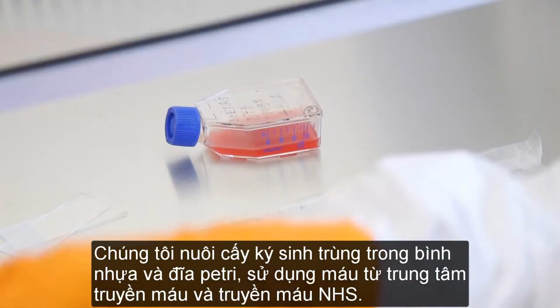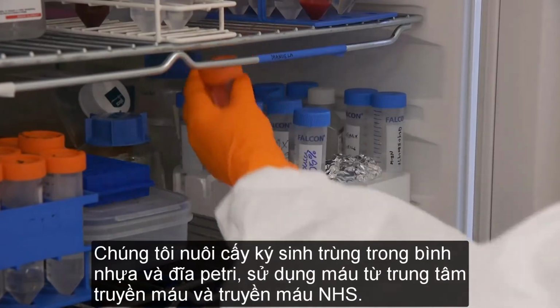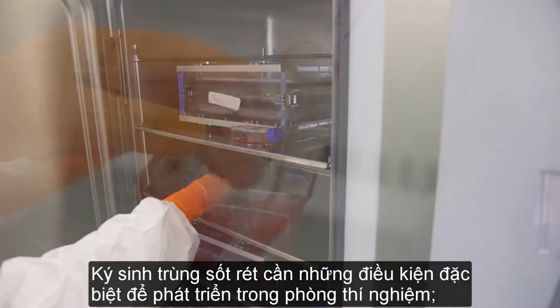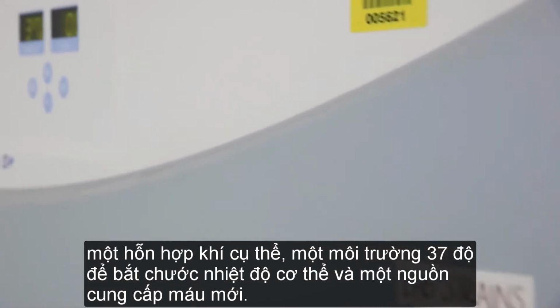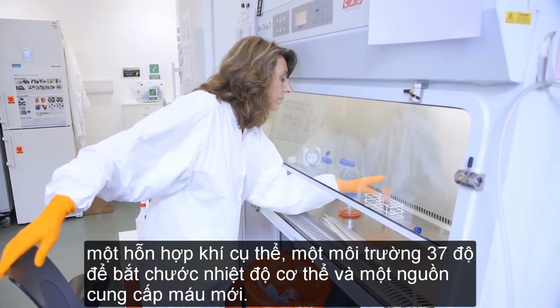We culture the parasite in plastic flasks and petri dishes using blood from the NHS Blood and Transfusion Center. Malaria parasites need special conditions to grow in the lab: a specific mix of gas, a 37-degree environment to mimic the body temperature, and a fresh supply of blood.